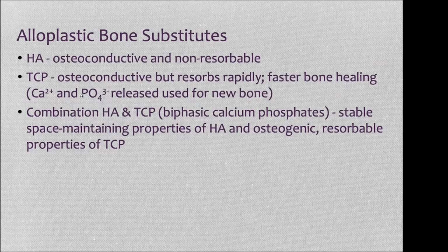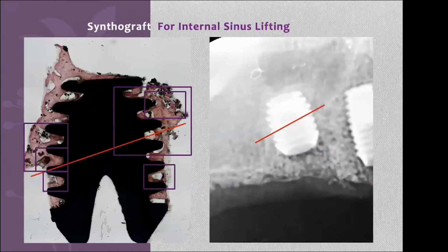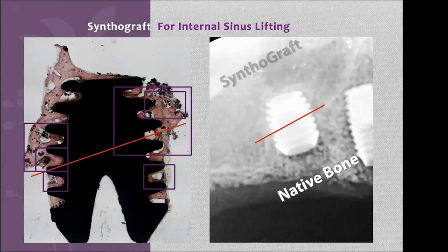And recently I've had the pleasure to work with colleagues, Dr. Larry Evers, Quello, and Bonfante, and we published this paper from one of our patients who wanted to have non-metallic implants placed and insisted on having his Bicon implants, which were functioning beautifully, removed. And the paper shows a series of analyses of the slide after we retrieved this implant that was placed with a sinus lift using SynthoGraft. This was the original line of the native bone. Above it is the line where the SynthoGraft was introduced, and below it was the native bone.